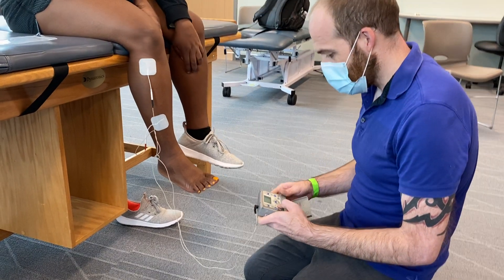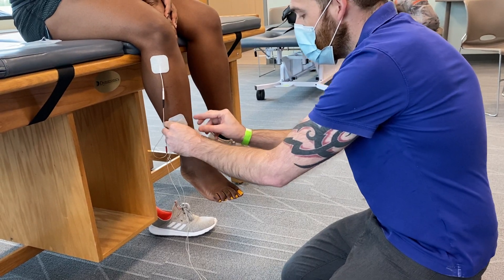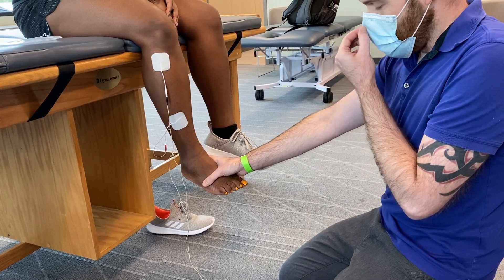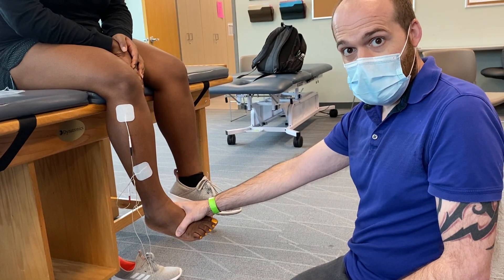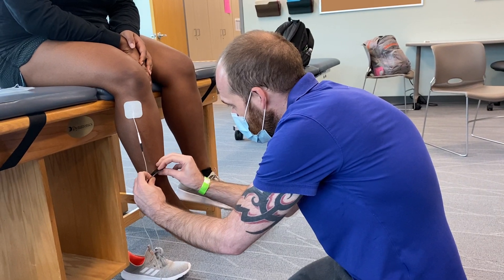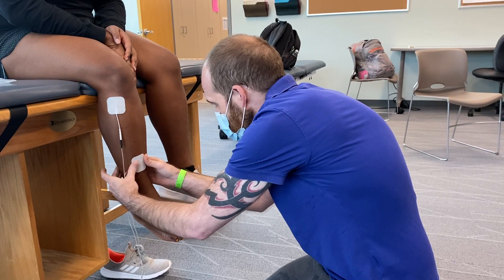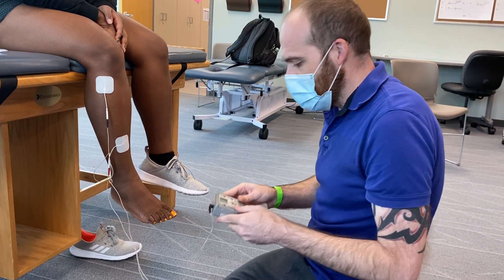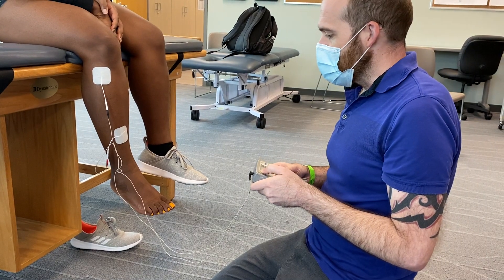The ankle is dorsiflexing but inverting, which means we've got too much stimulation for the inverter fibers of the anterior tibialis and some of the posterior tibialis. I'm going to pause it, take the bottom electrode, and move it a little bit more medial. Usually you just want to mess with one electrode at a time. I'll leave all my settings the same and try again.